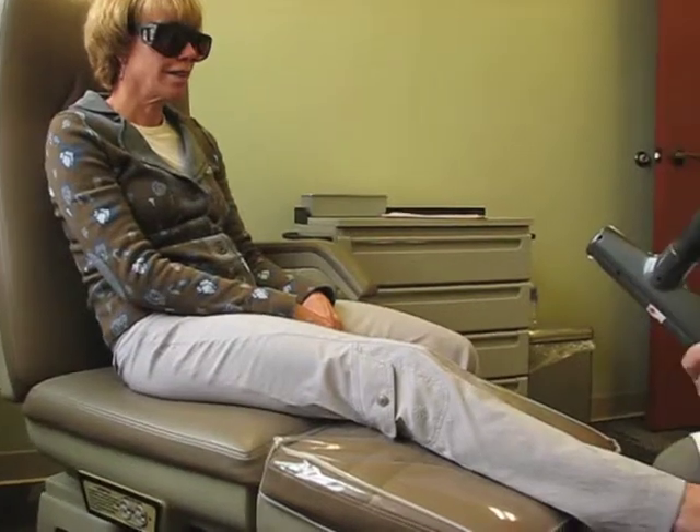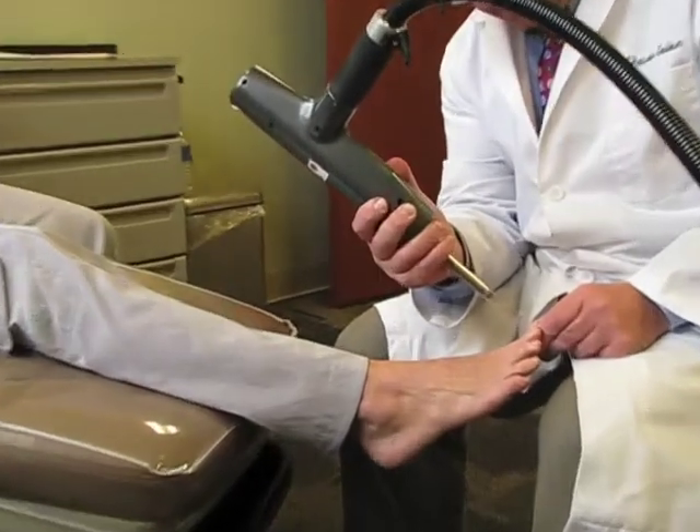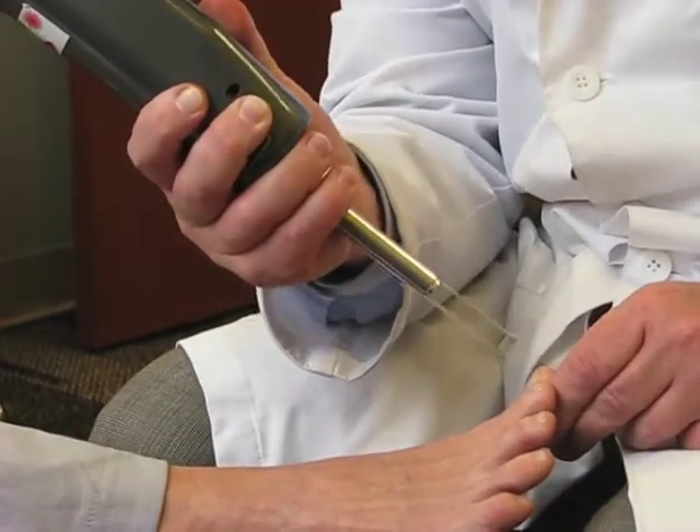You'll notice a mild warming of the nail. You shouldn't feel any real discomfort. And this just takes a minute. Are you comfortable? Mm-hmm. Good.